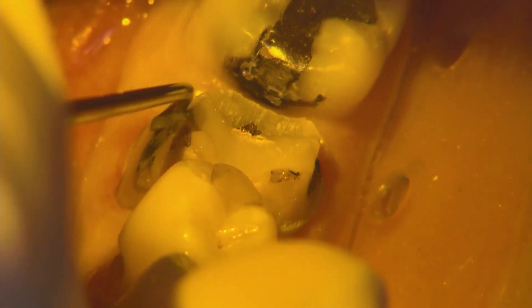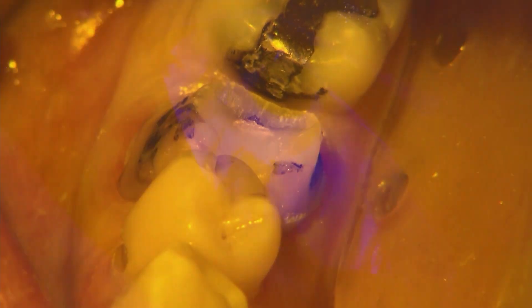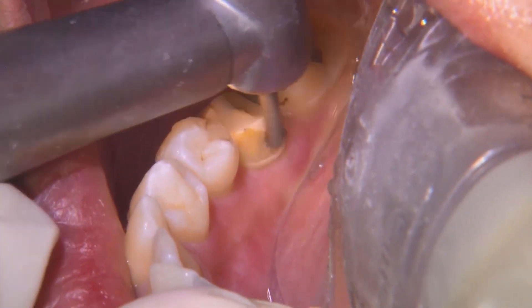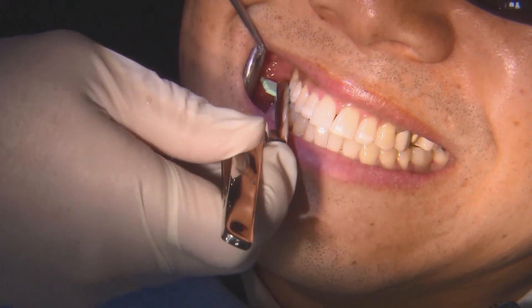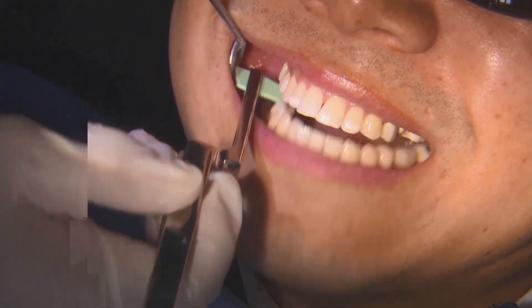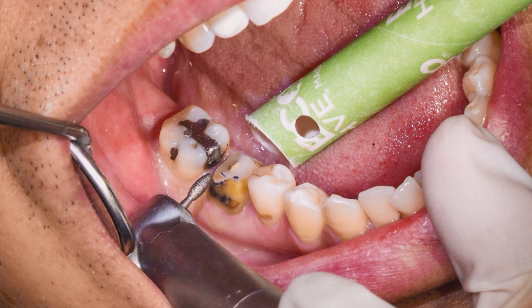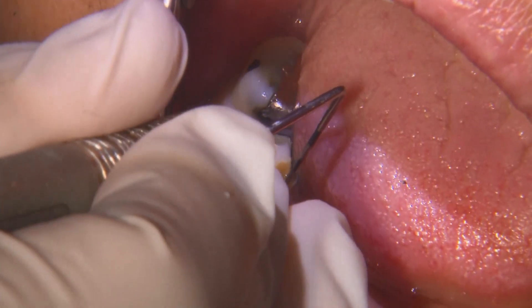Here I'm using a flowable. I like using flowable for a lot of situations — it adapts well to these different irregular surfaces, particularly on build-up areas. Then we're going to refine the preparation. For gross reduction I typically use a coarse-grit green-striped diamond burr — actually a round-ended tapered diamond burr. Occlusally it's usually a football or a rounded diamond burr. Once everything's smooth, I do the probe check to make sure all the margins are connected.